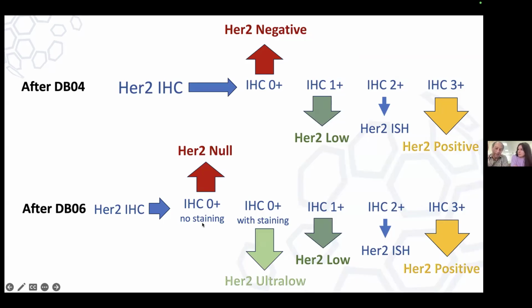And the added complication is that this diagnostic category you see here, and these ones you see here, are dependent on the HER2 status. So the manufacturers of the drugs that are supposed to be used with this started to use these categories dependent on the HER2 status. Now, this, to my mind, created a lot of confusion. And we said at the beginning, the pathologists need diagnostic categories, and we can name them. And then the action of whether you are eligible for a drug or not, it depends on the HER2 status, but that's another matter.